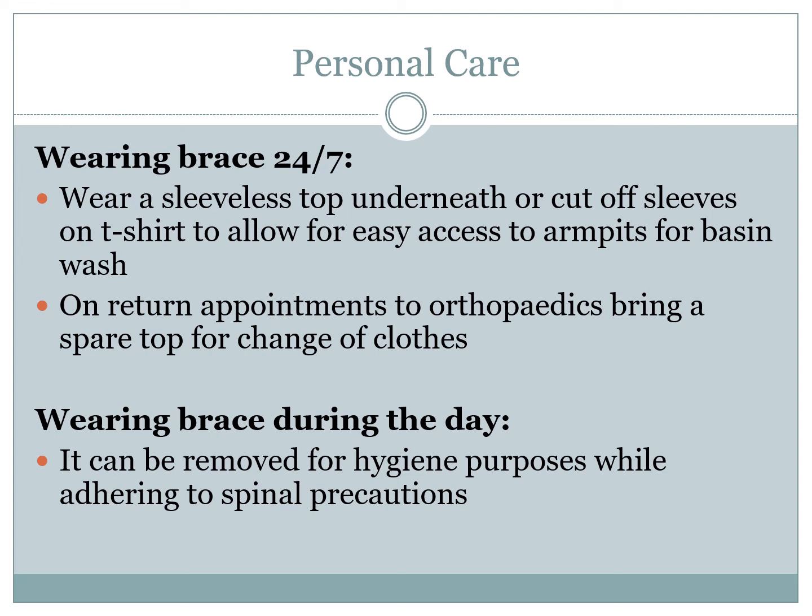We also recommend shampoo caps to patients who want to wash their hair. These can be purchased in most pharmacies. If the wearing regime of the brace is for during the day only and can be removed at night, then we would also advise that it can be removed for showers once the person is adhering to spinal precautions.